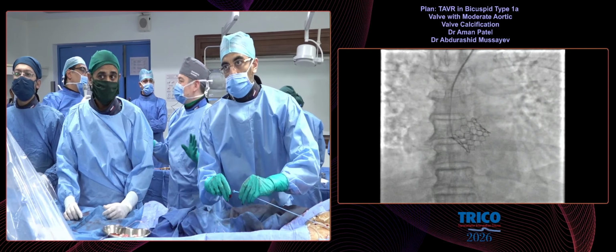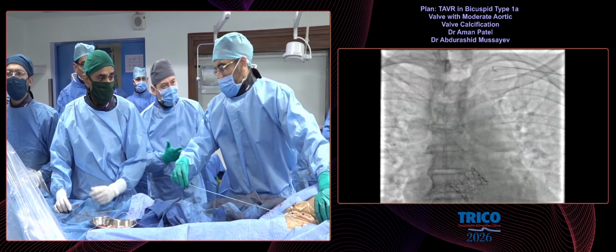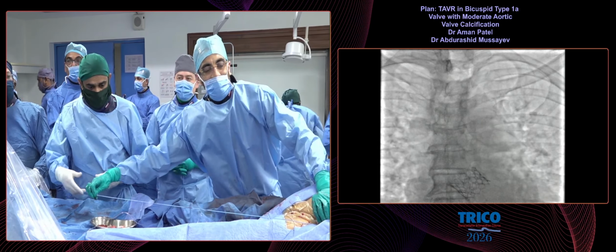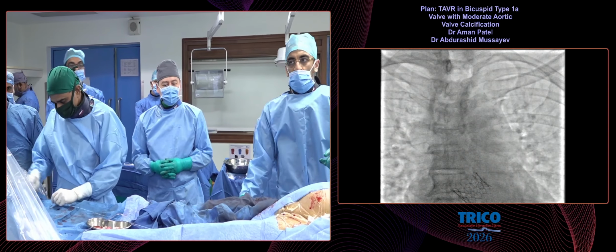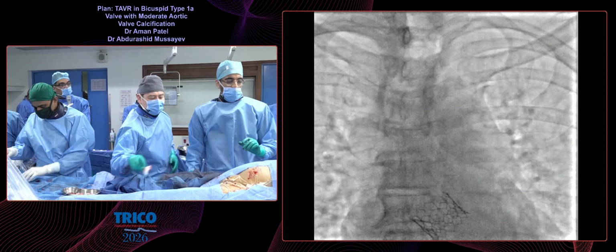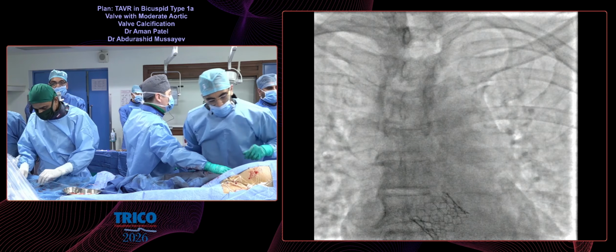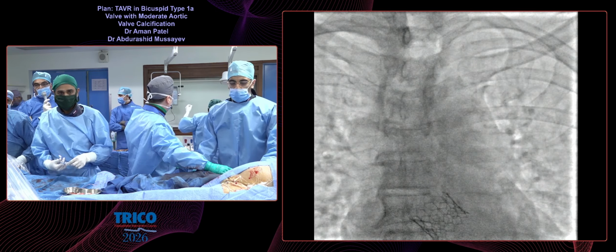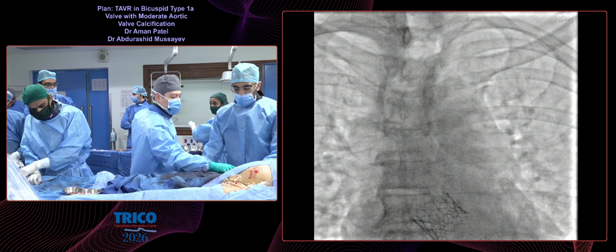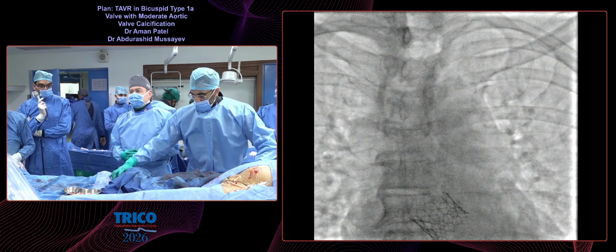We gave some propofol and some fentanyl, that's it, because the patient was very pain sensitive. But he's just on a regular oxygen mask, he's awake, arousable, but feels less pain. Do you use an additional A-line during the procedure, or just from the access? Just from the access. We just do conscious sedation.